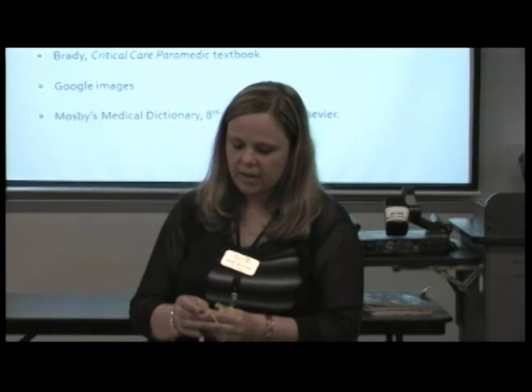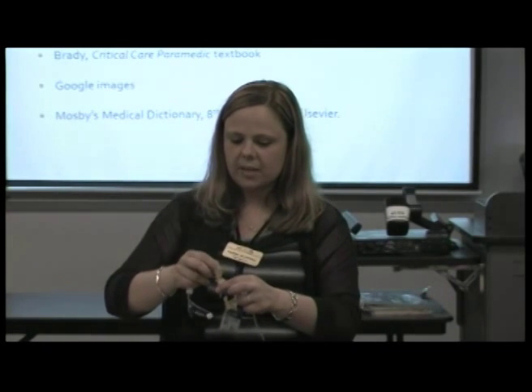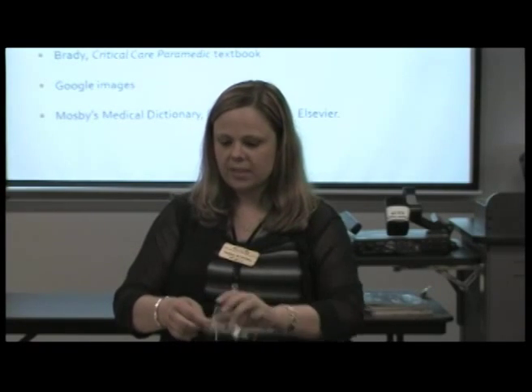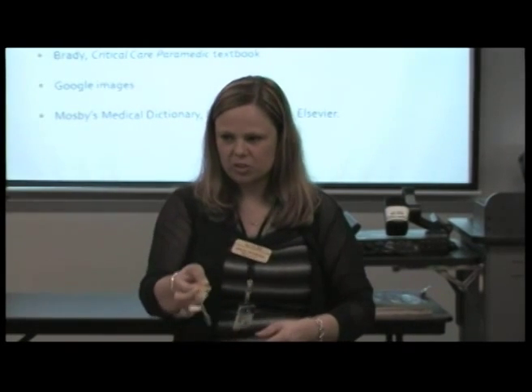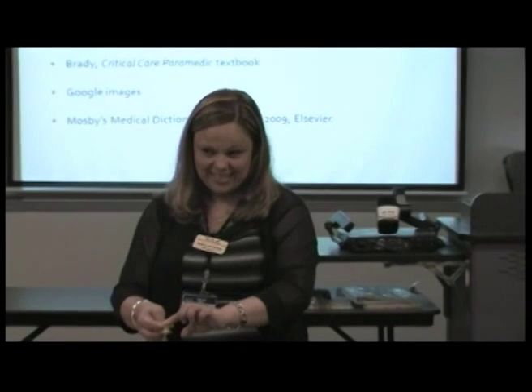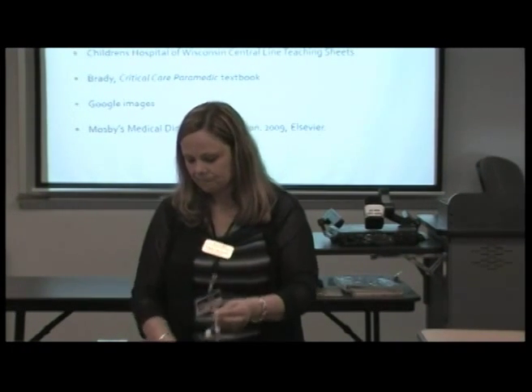So when we initially go into the med port and we have it secured, this is going to go in. These butterflies then relax out. Our dressing is going to go over the top, and I'll show you how I tape. I usually put the tape underneath and then put it over so it's really secure, so that if somebody accidentally does pull on it, it's not going to get pulled. The needle does just kind of sit in there, but the dressing usually holds it down nicely. Good question.